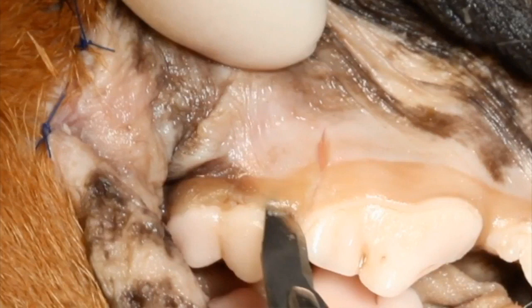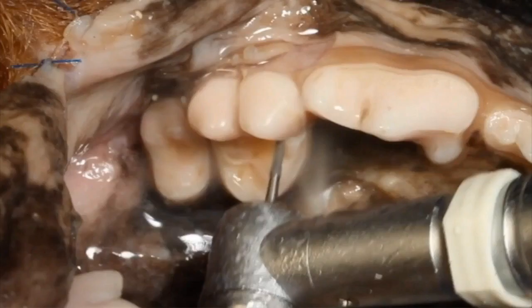When we go to section that three-rooted tooth, the crowns are definitely going to be facing us because we've got to see where we place that cross-cut tapered fissure bur in order to section it correctly. We make two passes — one pass there, and then a pass between the two vestibular roots in order to section the tooth. That's the position you would be in during that portion of the extraction.